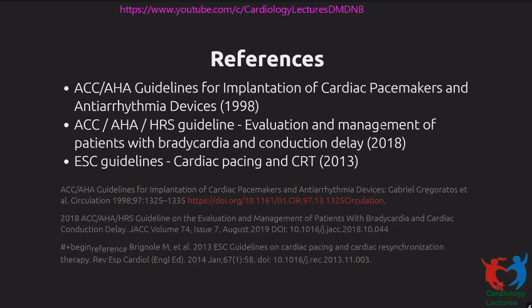Finally, when to choose His bundle versus left bundle pacing, I think that's a very broad question, and that's out of scope of this, but I'll very briefly answer that. If you decide to go for conduction system pacing, currently the two options are His bundle pacing or left bundle pacing. In terms of hardware, it's the same hardware for both. So it's the same lead, same sheath. So usually it's something that you can even go back and forth.